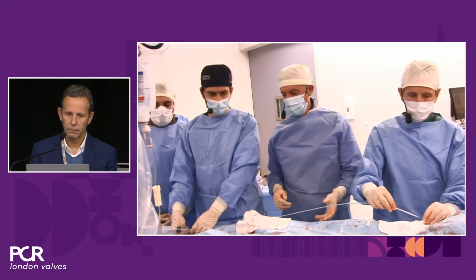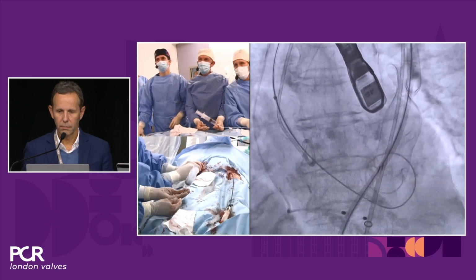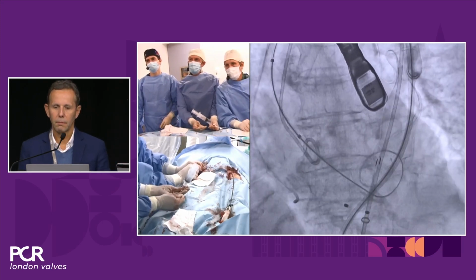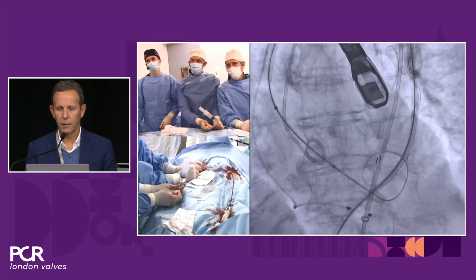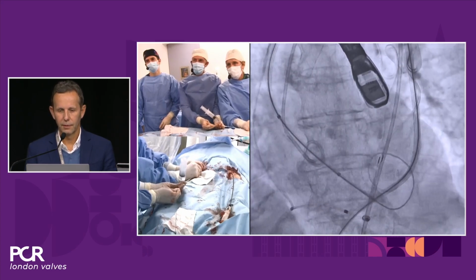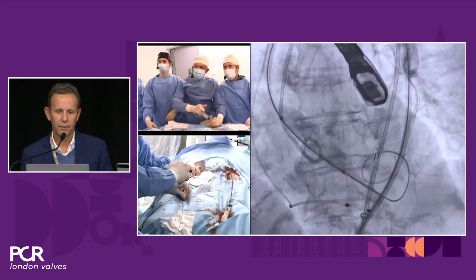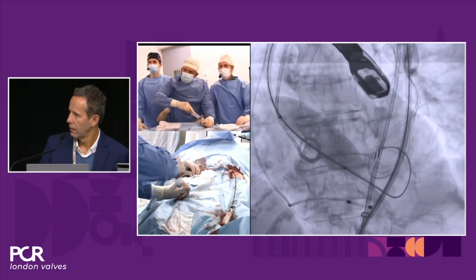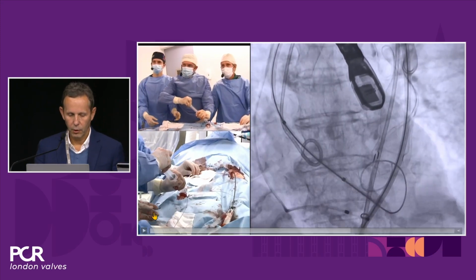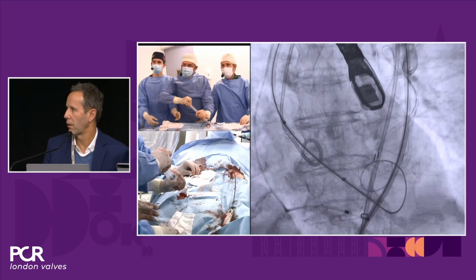Great. And in this case, we have chosen a 23 balloon. No interaction with the balloon and the Emboliner device, as you saw. A little hard to cross even with the balloon, huh? Yeah. Difficult to cross. Proves the point. It would have been hard to cross without it. Yeah. Mean gradient that was 75. Can you maybe... 23 millimeter balloon is relatively large. Okay, stop. 23 what? Balloon size. Yes, it's a 23 for a 26 valve, so a good Medtronic pre-dilation. Yeah, very effective. Yeah.